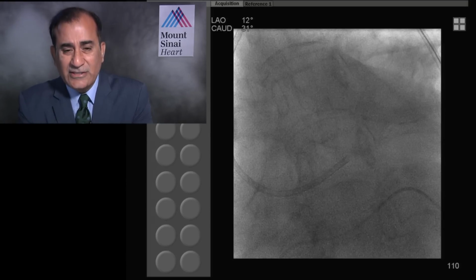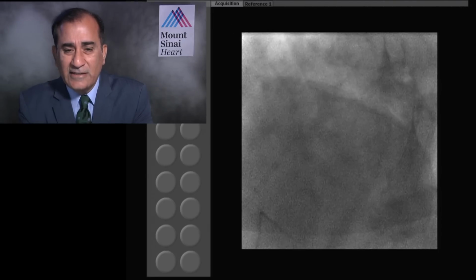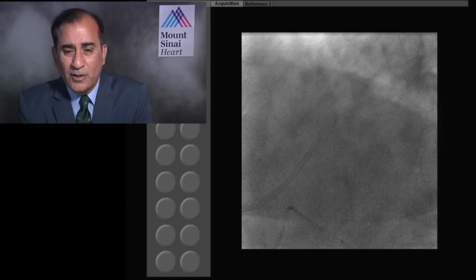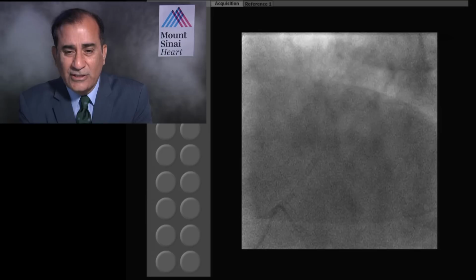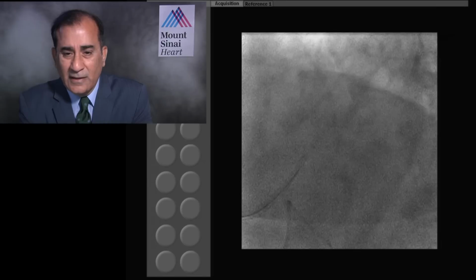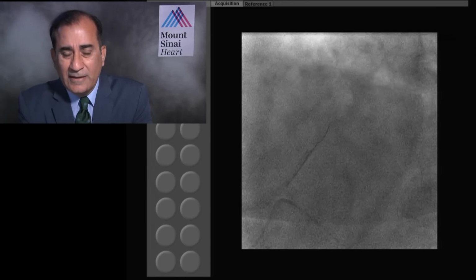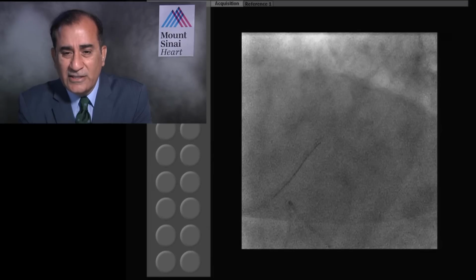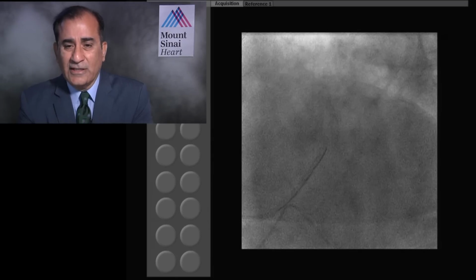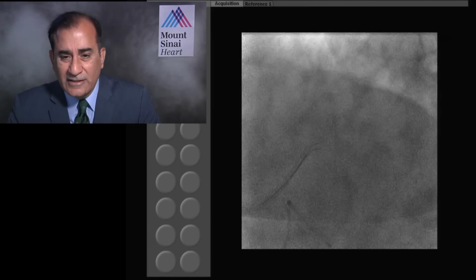Dr. Altir mentions that he recently did a patient with a STEMI for the RCA who had an aneurysm in the proximal LAD, for which he was recommending surgery, and for the comorbidities the patient did not go for surgery. So he's looking forward to your case and how the aneurysm behaves after stenting. Dr. Altir, welcome to the webcast, and hopefully this will be an educational case for you, not only for the unprotected left main PCI, but specifically to your observation regarding the aneurysm.